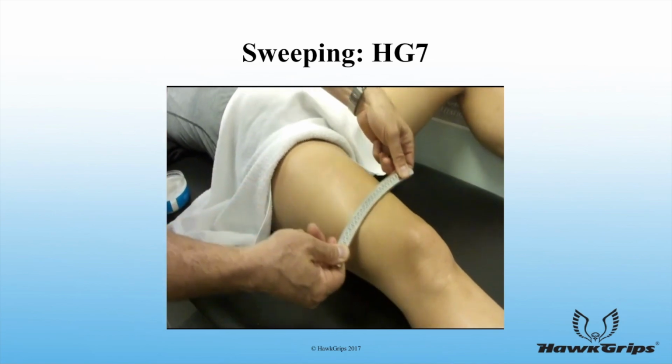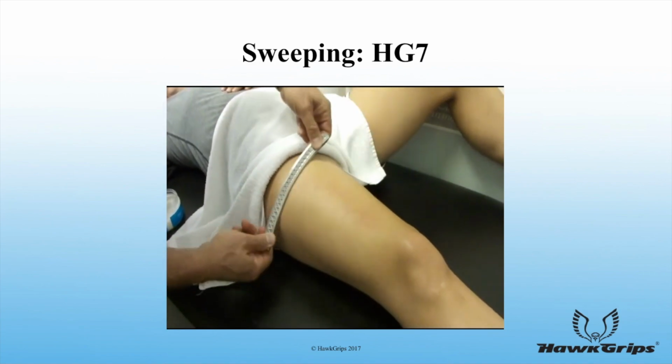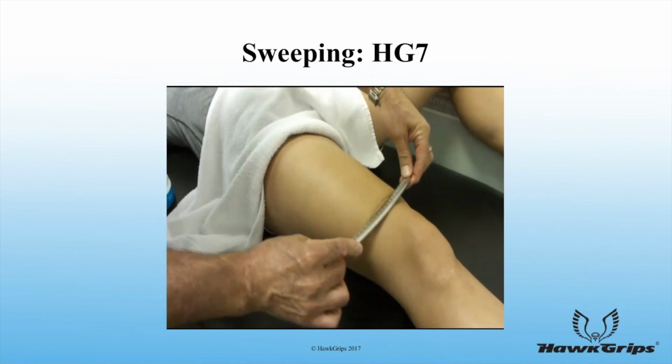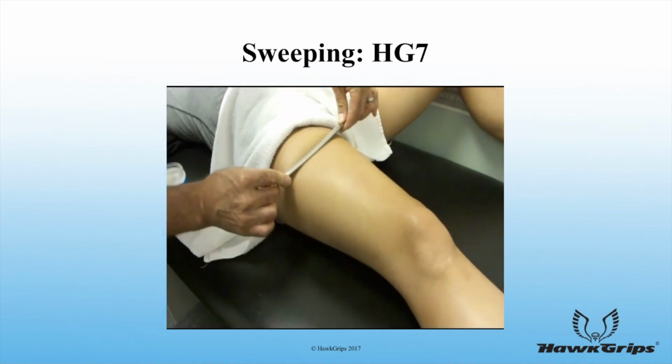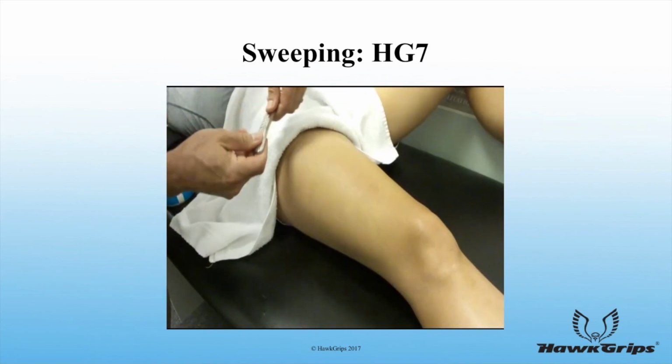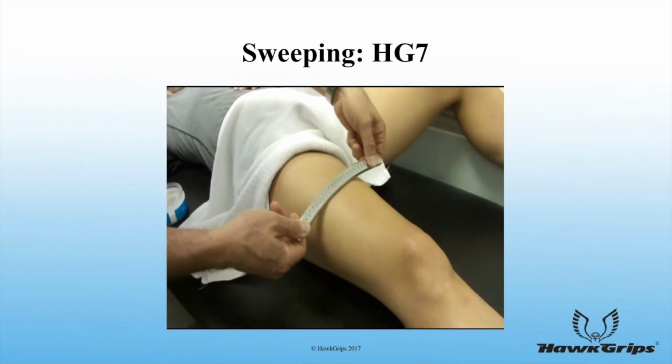When returning the instrument back to the starting position of the next treatment stroke, the instrument can be lightly dragged across the patient's skin. You do not drag the instrument back and forth while engaging the target tissue with treatment pressure, as this can be uncomfortable to the patient.